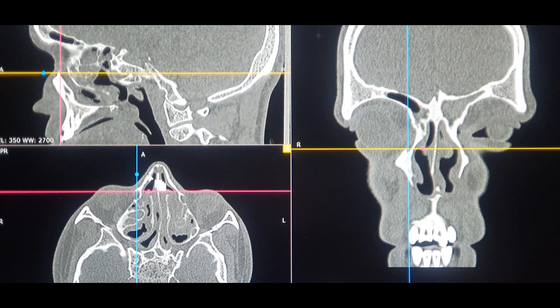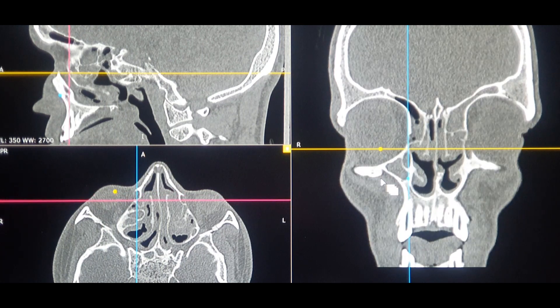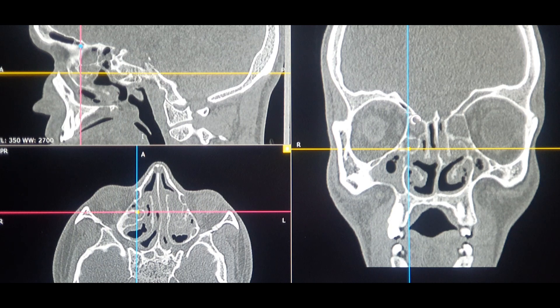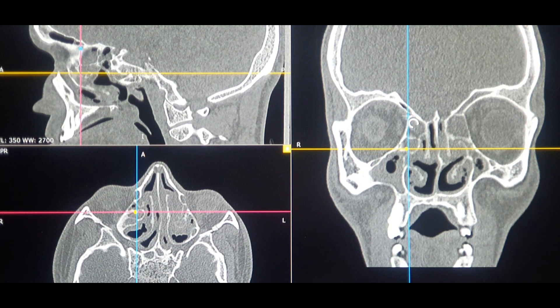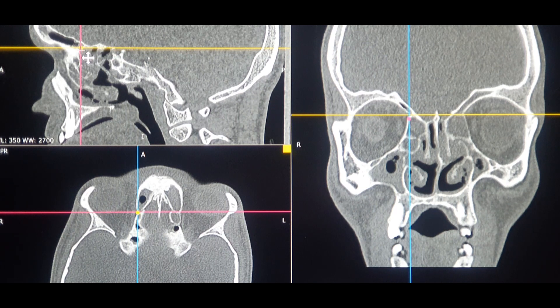The second step is to go posteriorly to locate the anterior ethmoidal artery. On the coronal section, I keep going behind until I find the anterior ethmoidal artery. The moment you see the conical appearance of the medial wall of the lamina papyracea — that is the Kennedy nipple sign, at the confluence of the medial rectus and superior oblique muscles — that is how you locate the anterior ethmoidal artery. On the sagittal section, you can see this is the anterior ethmoidal artery, and this was roughly the area of the anterior lacrimal crest.